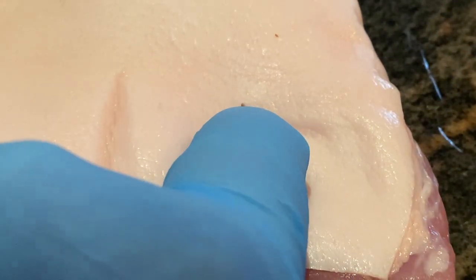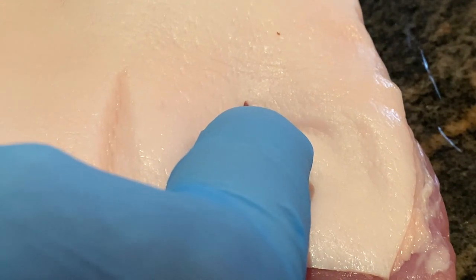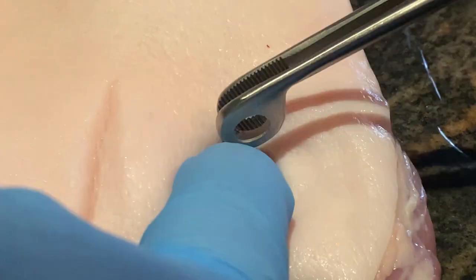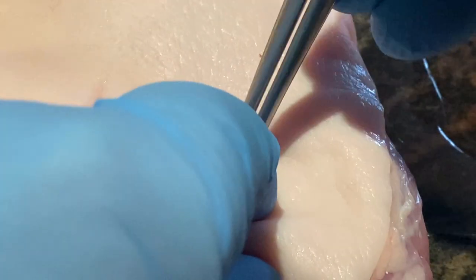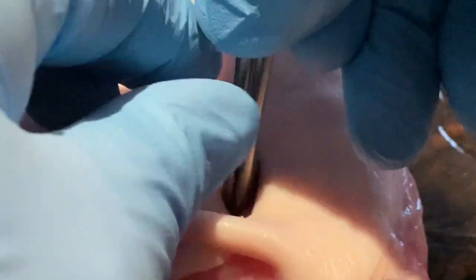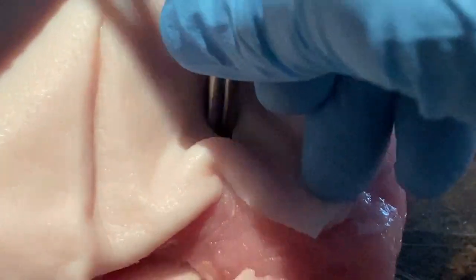We then use our finger to push and palpate the intercostal muscles, while we use our curved forceps to push through the intercostal muscles themselves into the pleural space. This may require some force.